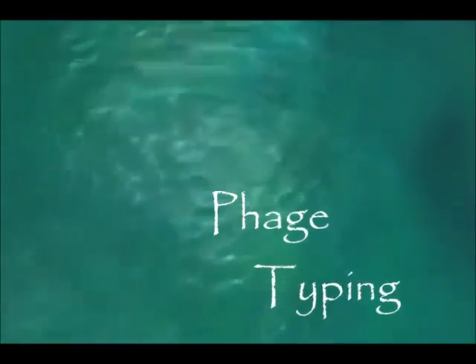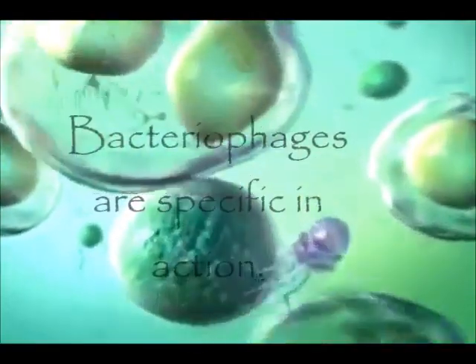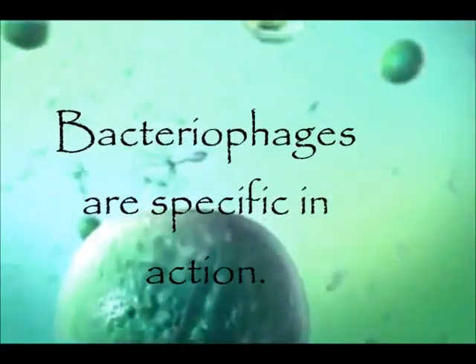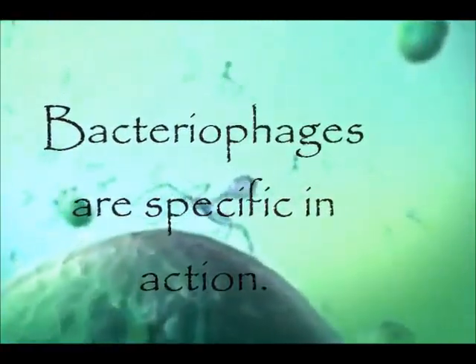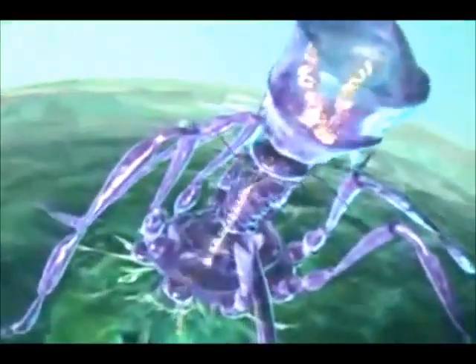Phage typing. Bacteriophages are specific in action. A particular phage may be very specific and infect only a few strains of a bacterial species. At the extreme, another phage may infect strains of two or more species of a particular genus.